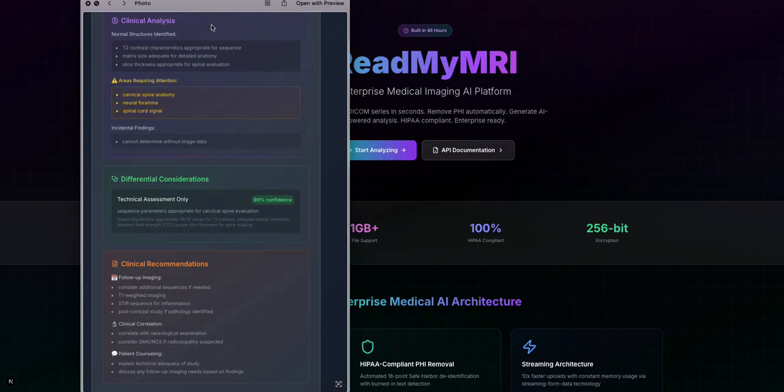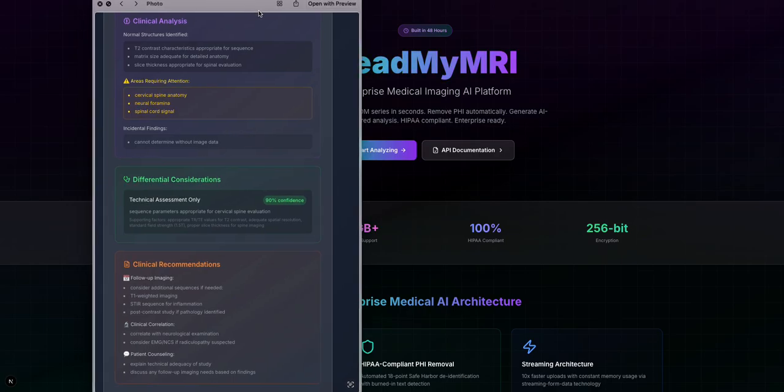Unfortunately, what you'll find with DICOM images, the meta tags are a mess, and so getting it to function properly, I don't have another DICOM on me right now, or I would do an actual test on screen. But here's what you can see the analysis looks like.